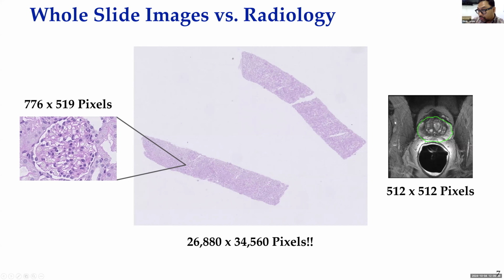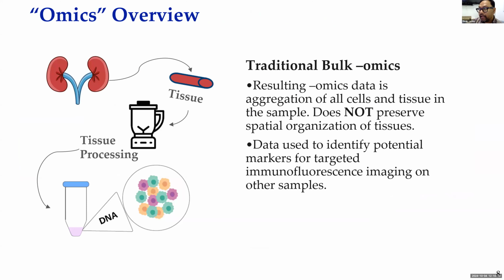So in histology, this is the amount of data we are talking about. And when we data scientists work with this data, we deal with the massive dimensionality hidden in it, to infer a massive amount of information which may not be discerned well when someone is visually examining this data.